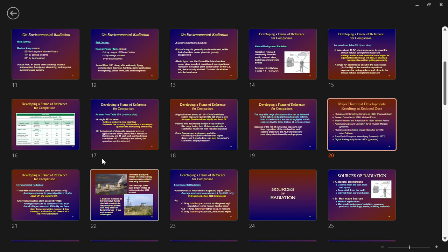So all you need for film, right, you need the photographic film, right? So you need the film, you need film cassettes, right? And then you need a processor, right? The processor is just a wet film processor that drags the film through it and produces the processed film image. If you remove those things and then just bring in a digital system, you don't have to do anything to your x-ray machine, which is nice. Your x-ray machine can work the same.